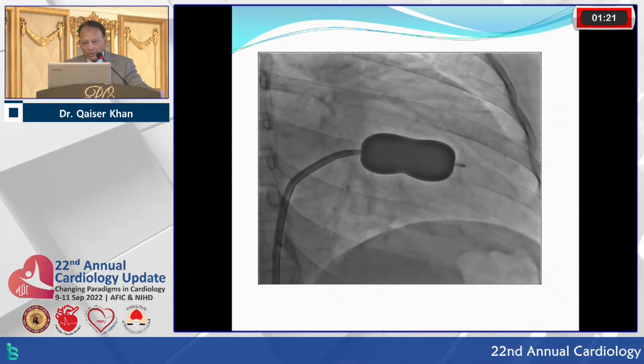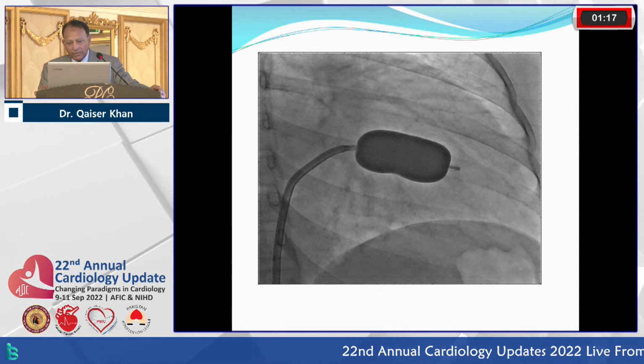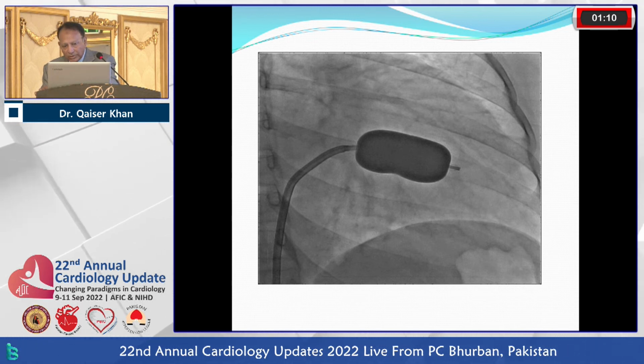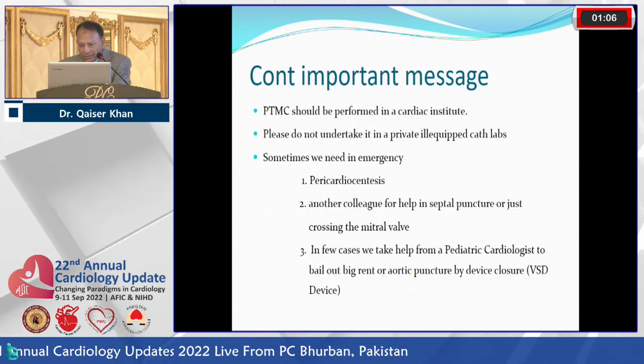I wanted to show you Suhail's technique, but we could not load that video. So here blindly we are inflating it. In Suhail's technique, we are sure that it's at the mitral valve. We have to give simultaneous injection.